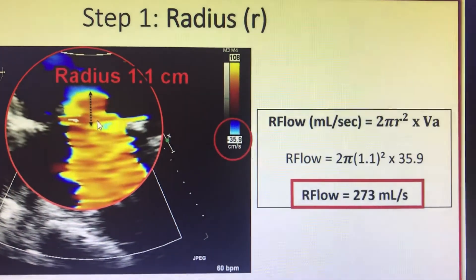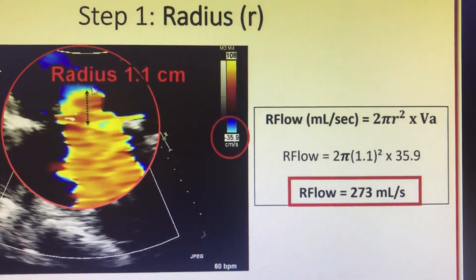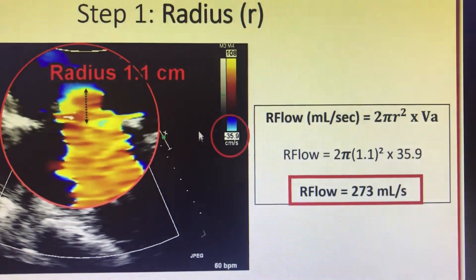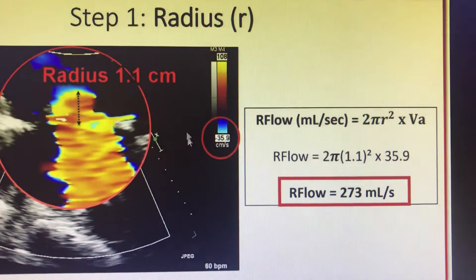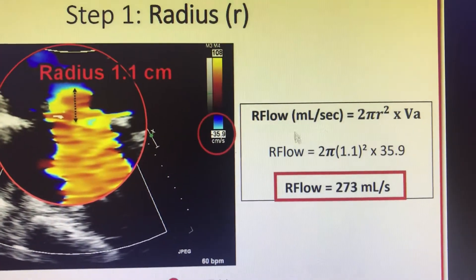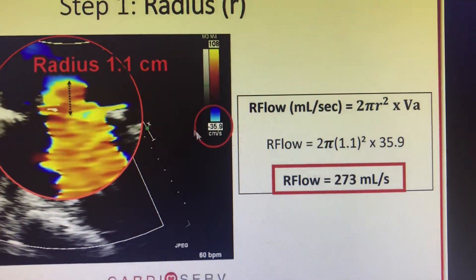You measure the radius when the hemispheric jet is created at which aliasing velocity you decide it, that is 35.9. This will give you the regurgitation flow. As we discussed, regurgitation flow in ml per second is equal to 2πr² times aliasing velocity.